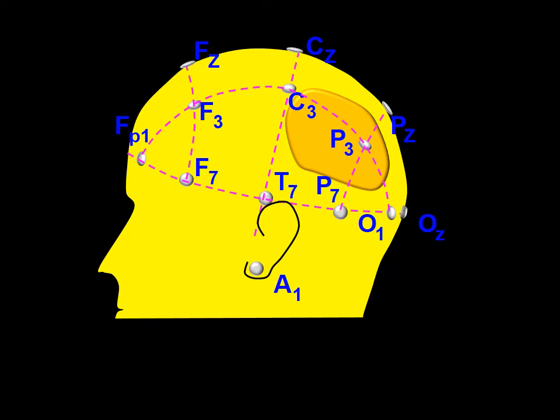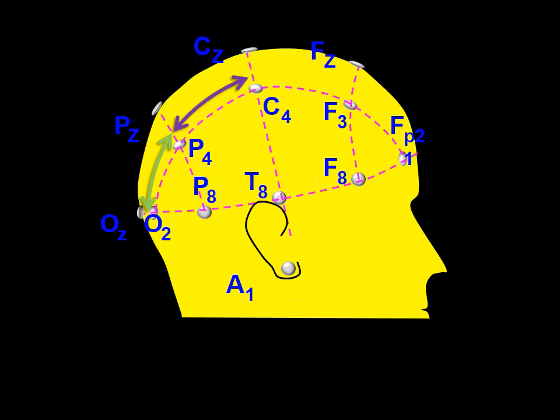The same exercise should be done in the anterior to posterior line. In this case, the P3 location should be half the distance between O1 and C3 at the level previously selected. So, if the distance between C3 and O1 is 10 centimeters, P3 should be placed 5 centimeters from each of them.